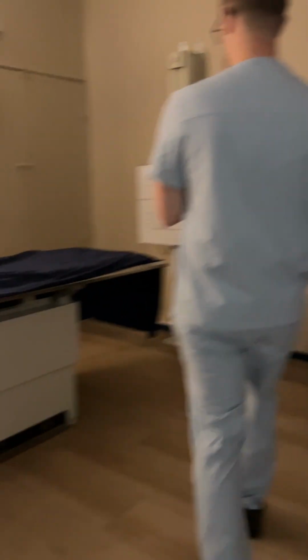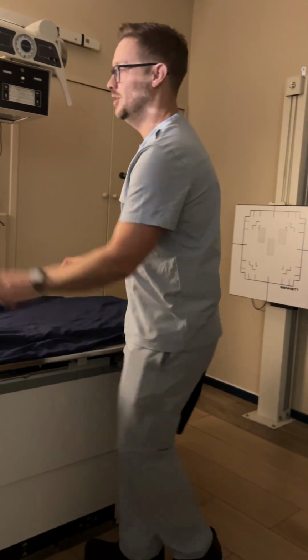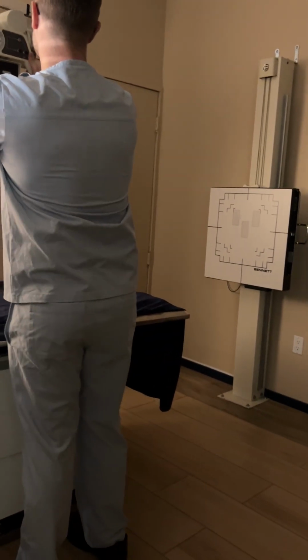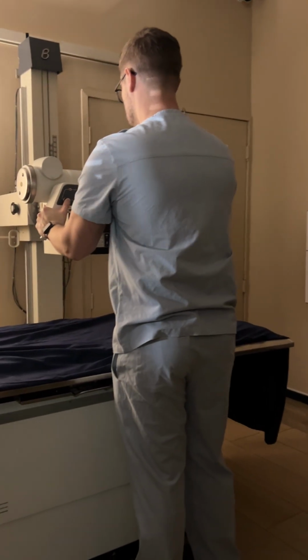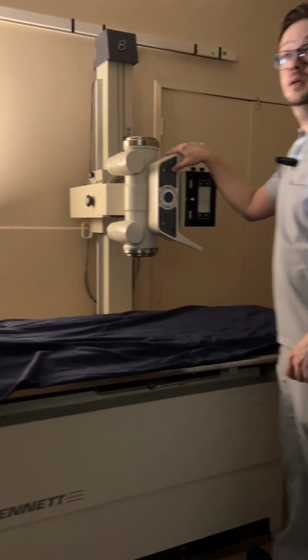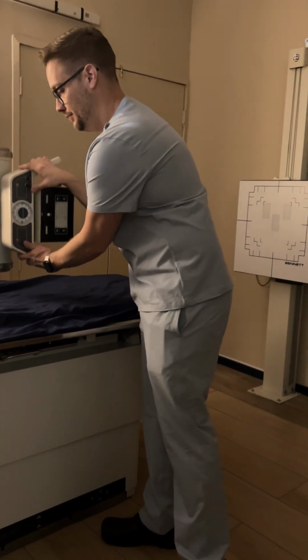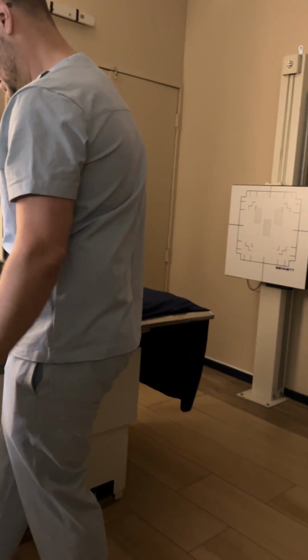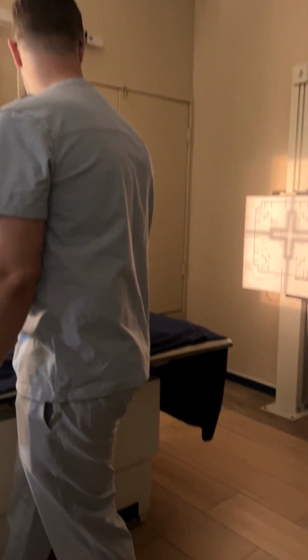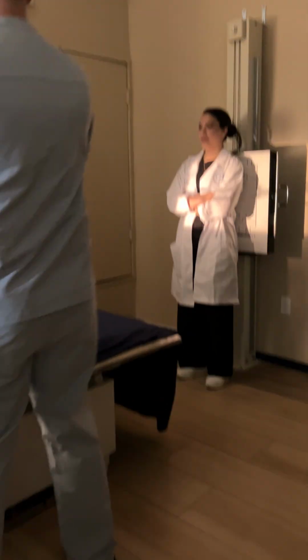All right. So now we're going to do an acute abdominal series. The second image is an upright abdomen. I'm positioning Noor.